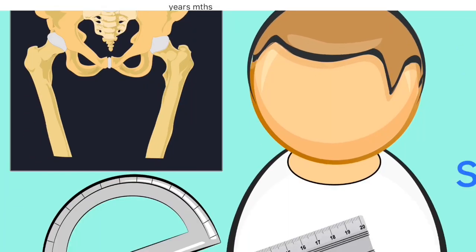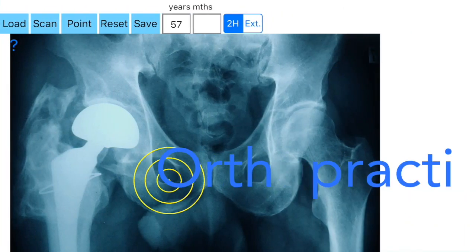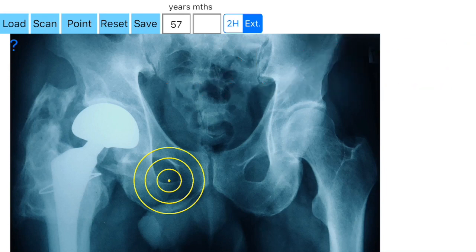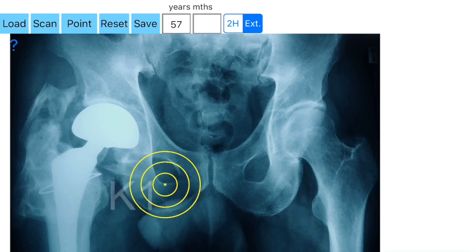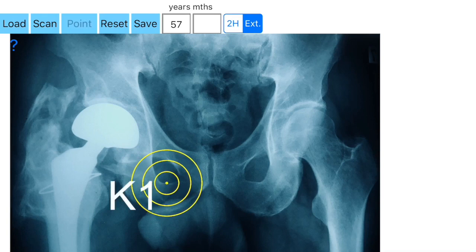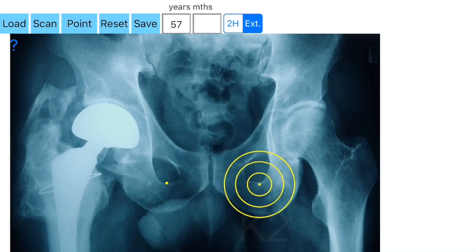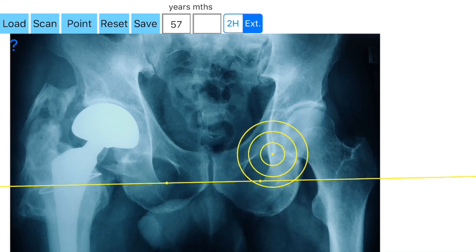In cases where you have leg length inequality, unilateral luxation of the femoral head, THR, or obliquity, you can choose another way to measure the AA angle. By pressing the option 'next' you activate another method of marking the points. Instead of marking both teardrops C1 and C2, you mark two points — first right K1 right, and then left K2 left — through the ischial tuberosities or inferior border of the obturator foramina, depending on which was more symmetric and accessible. A horizontal line K1-K2 is drawn and appears on screen.